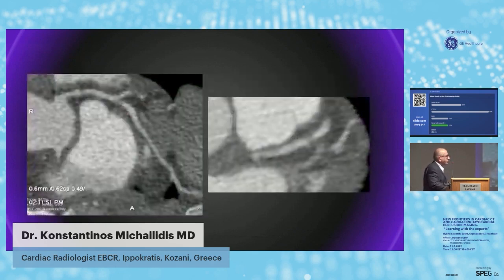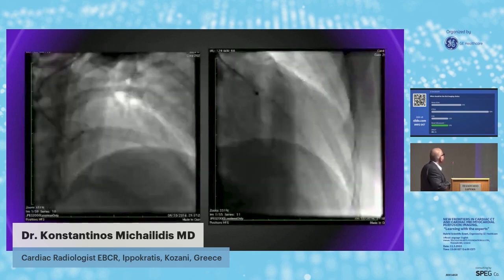So we have a finding to account for the hypertension. But Stelios told me to do a CT angiography too, and unfortunately I saw this. You see, that's a very bad quality. I tried to do it at very low dose. I reached the adrenals with 100 DLP, nothing. But the calcium score was 0, the pretest probability was low, and then I see this. And you're like, okay, now what do I do?